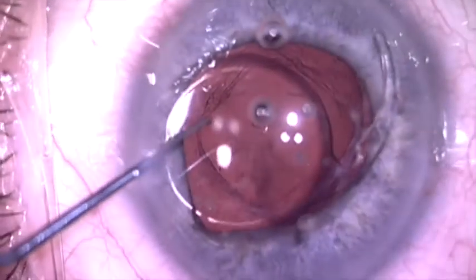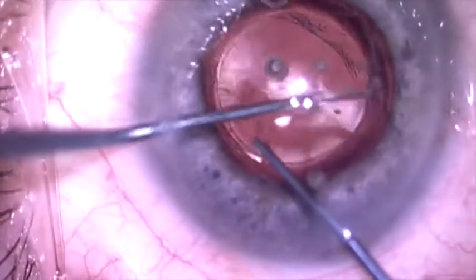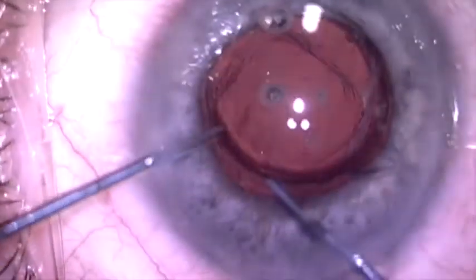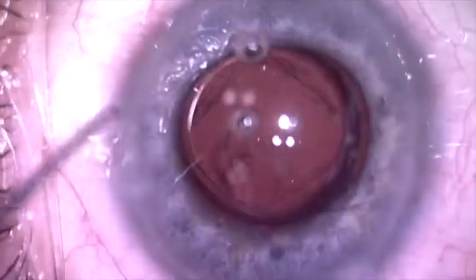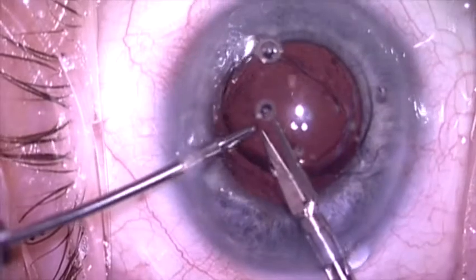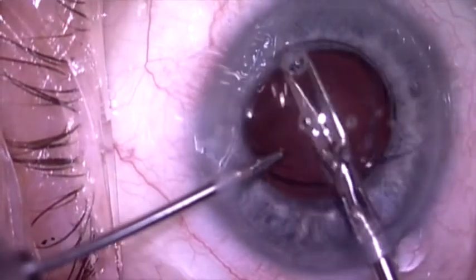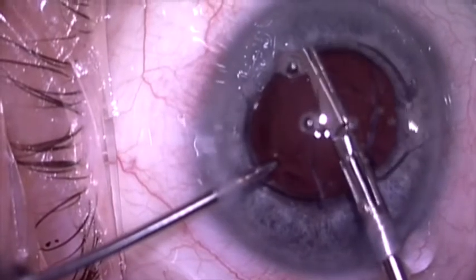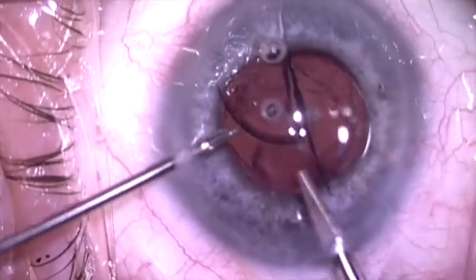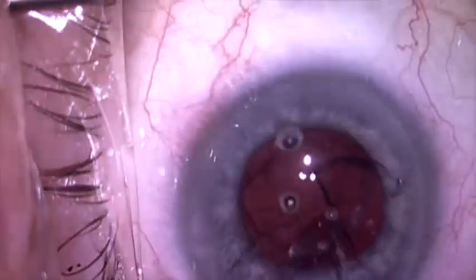The lens is prolapsed up out of the capsular bag, and now I'm going to cut this in half and take it out in two pieces. I'm very careful when I do this to try not to disturb the vitreous so that it won't prolapse out through the incision. Here we are cutting the lens in half, and I'm very gently going to take this out in two pieces.